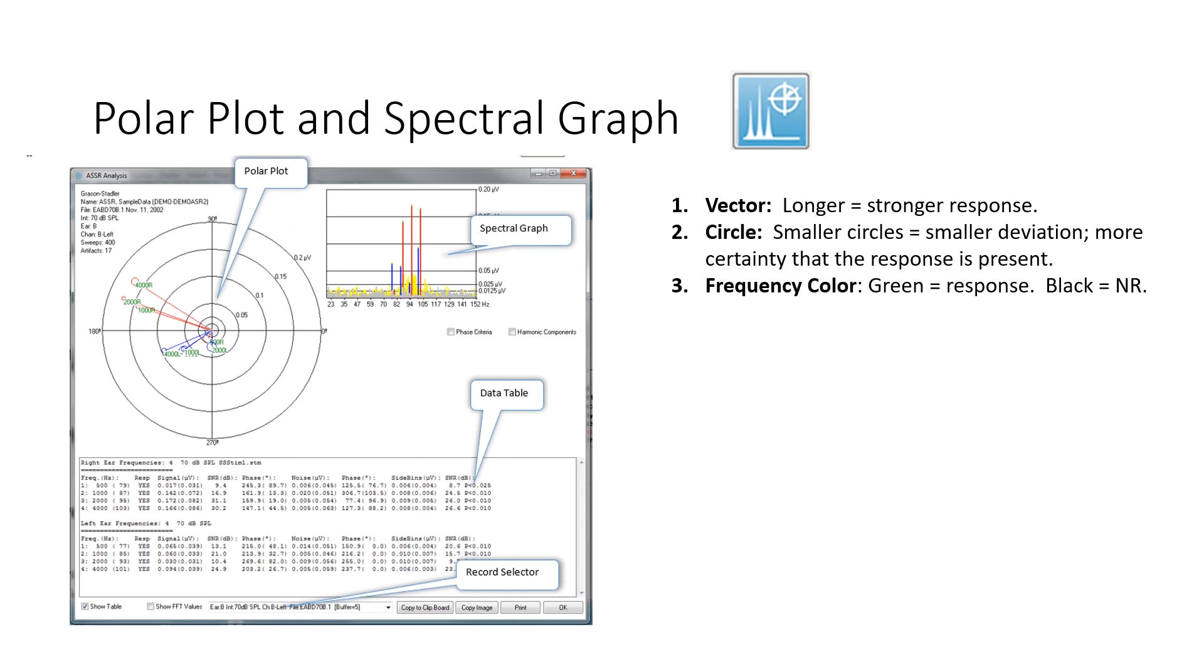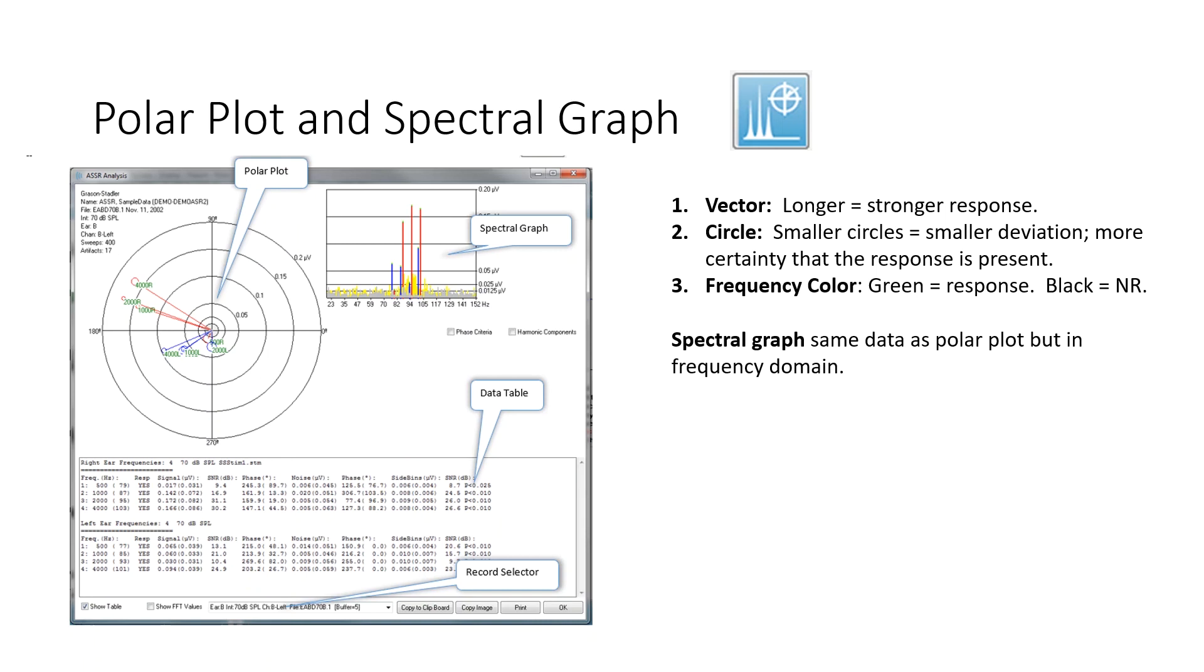Now the spectral graph is that exact same data plotted in the frequency domain, so amplitude over frequency. The frequencies, if you look at those, are the frequencies of the modulation.